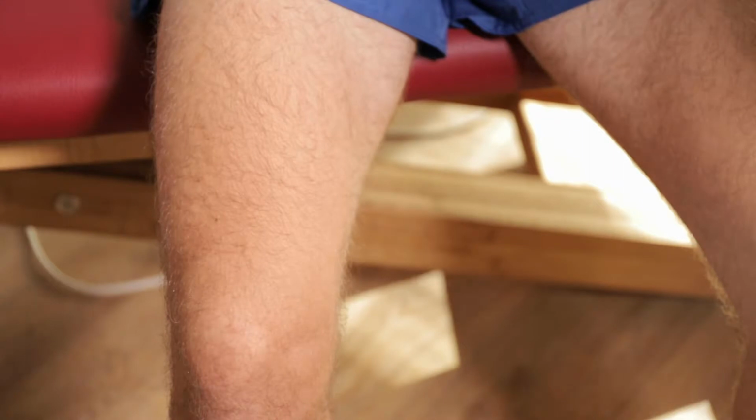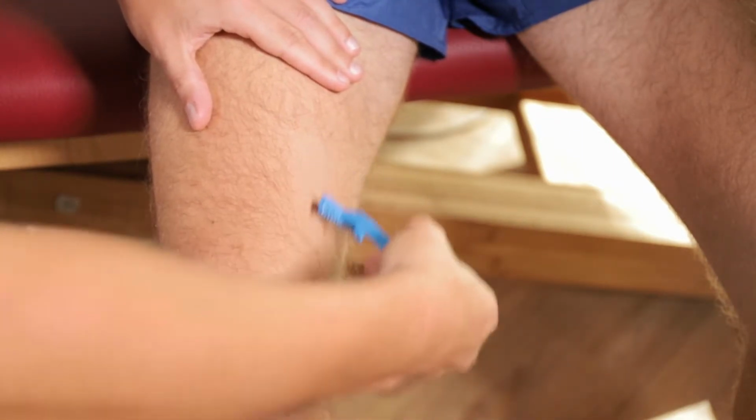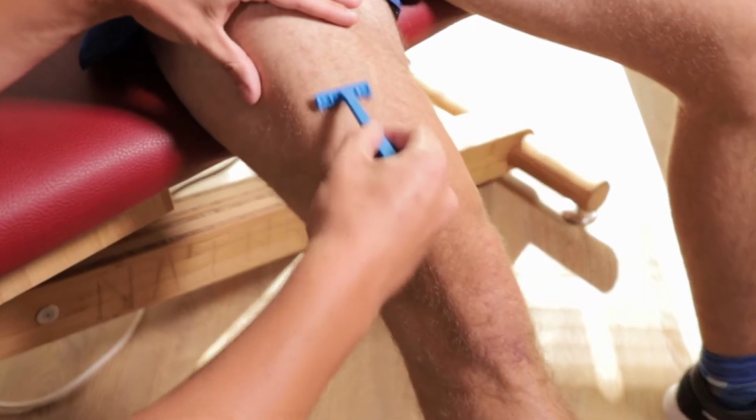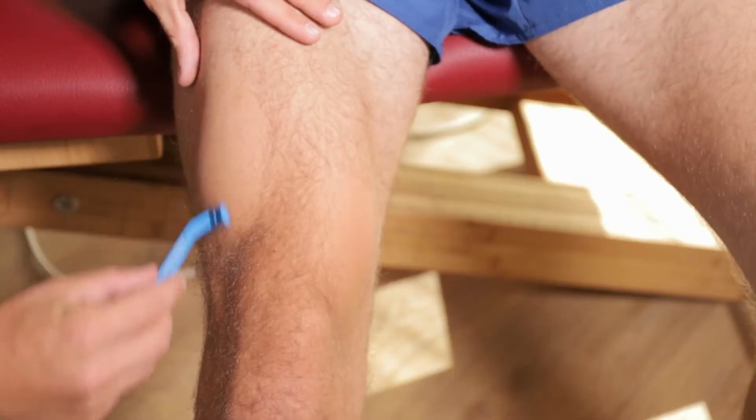Step 1. Lowering the skin impedance. One of the most important and fundamental preparations to increase the quality of your EMG signal is the skin preparation. After shaving the body hair, there are different methods to clean the skin and remove dead skin cells to lower the skin impedance. Before you start cleaning the skin, make sure that the subject has not applied lotions or similar.